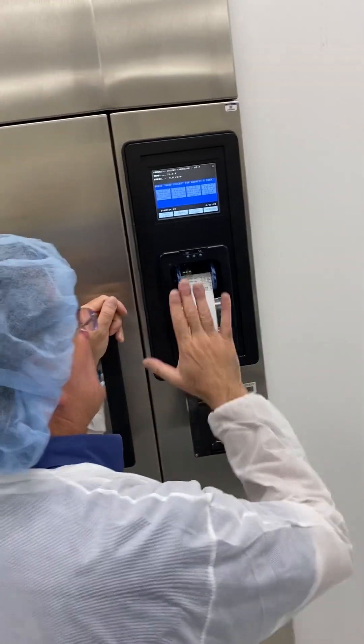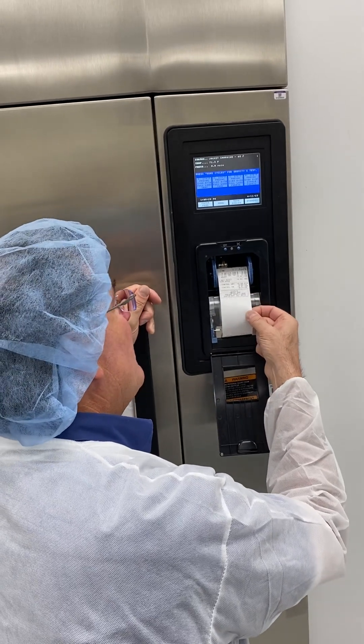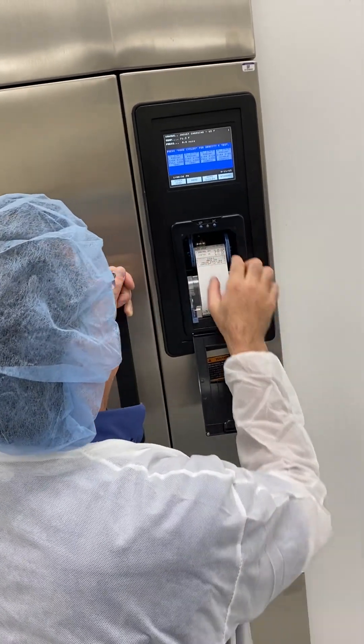It's up to you how you want to store your sterilization record, because this is a sterilization record that has to be kept for seven years. We've got the take-up reel, just like the other machine.